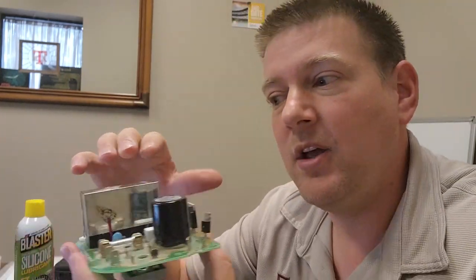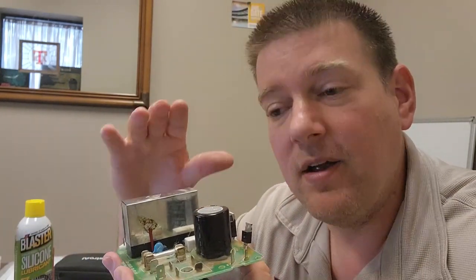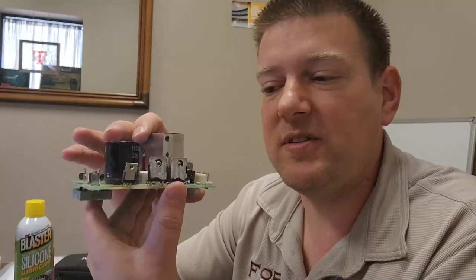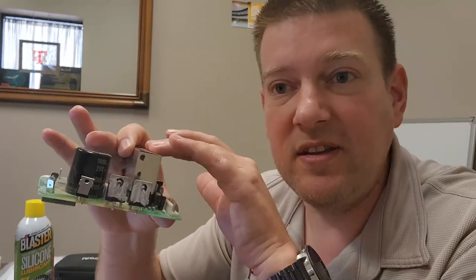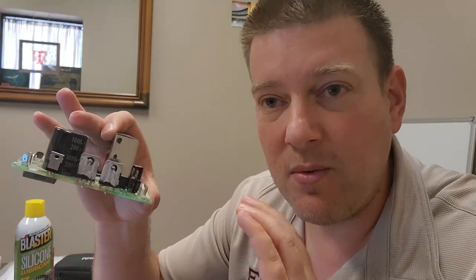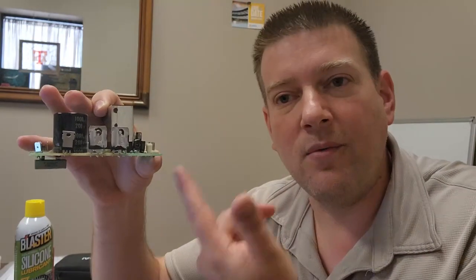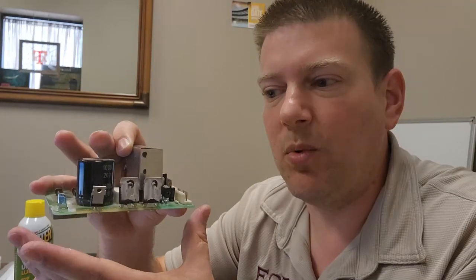So the SCRs were running, which tells me that the brain box in here was technically doing its job. It also tells me that the control signal over here, when I hit start, the computer that is up in the console, was also working because I could hear the SCRs click. So now, what could possibly be the problem? Well, the first thing that I did is I desoldered the brain box right here, and I wanted to make sure that it wasn't discolored up inside because it is filled with epoxy. So I desoldered it, checked it out, and then I resoldered it. All right, that one seems to be working fine.